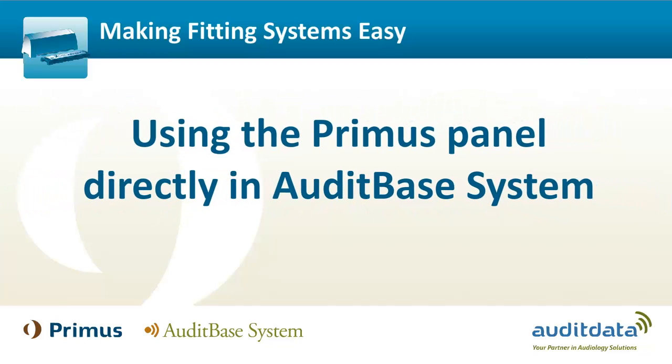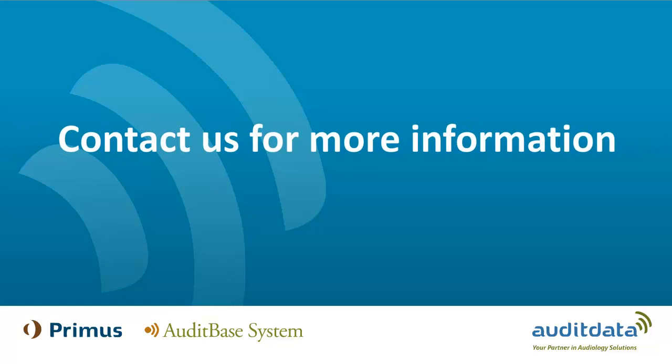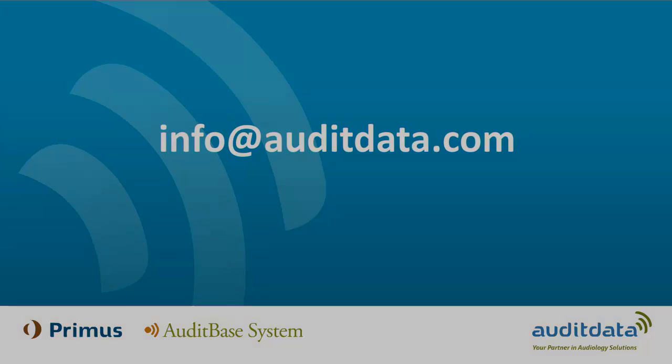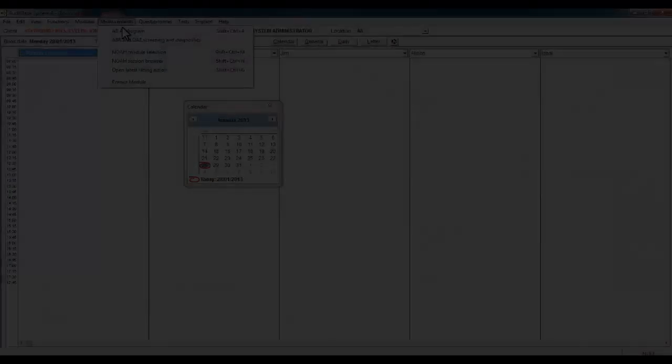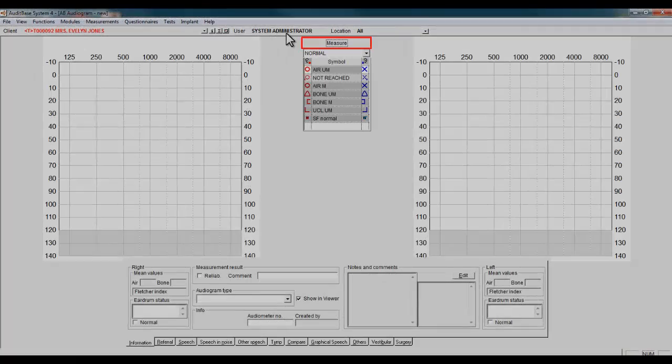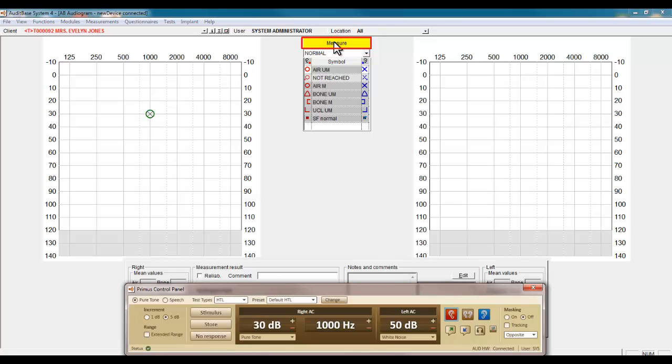There is no need to open the Primus measurement tool separately, which will allow quicker access to your Primus audiometry needs. As you enter the Measurements section of AuditBase, click on Measure and you will see the Primus panel appear instantly.